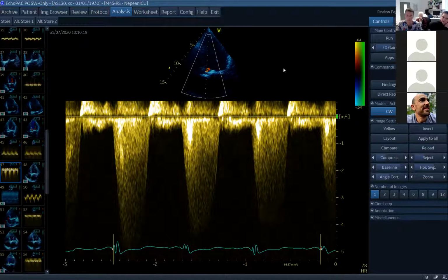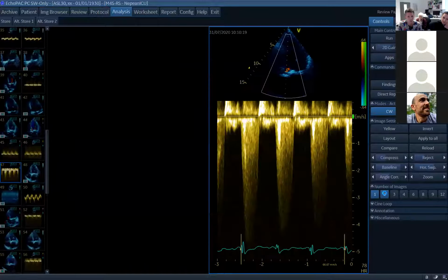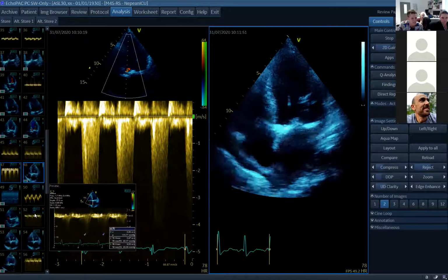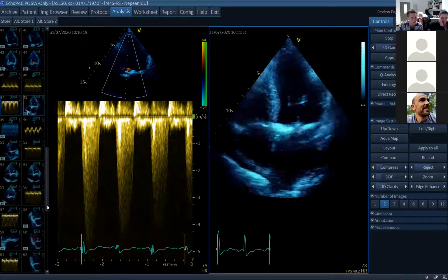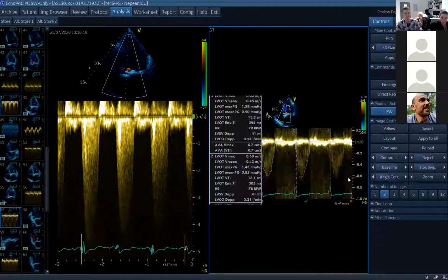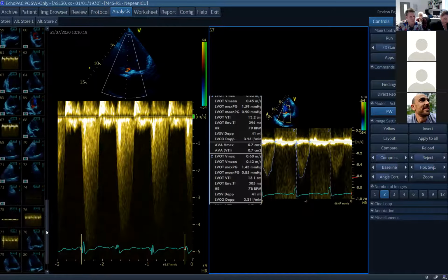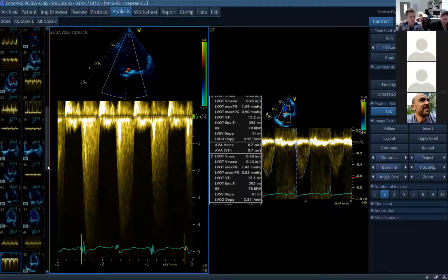Beautiful. Does that make sense to everyone? Do we understand that? So the idea is, is this severe or not? We've got a bad LV function. So if we particularly did that one with, where's my LVOT? So your DSI should still be accurate. I think I'll do it like that. Hang on, let me do it like that.